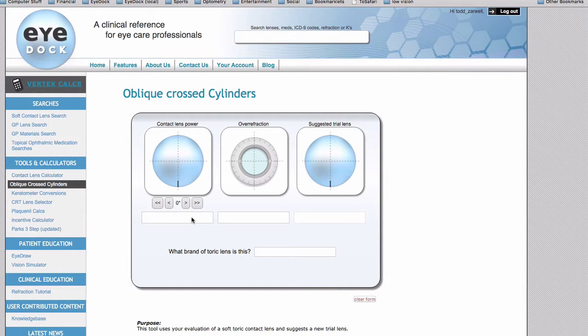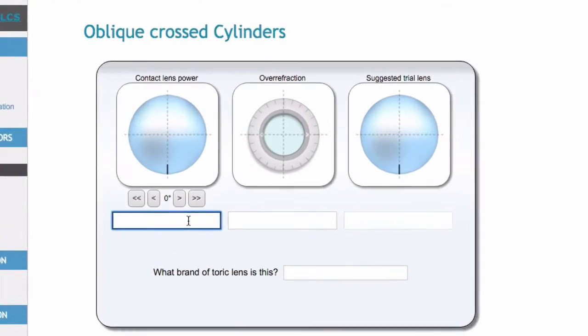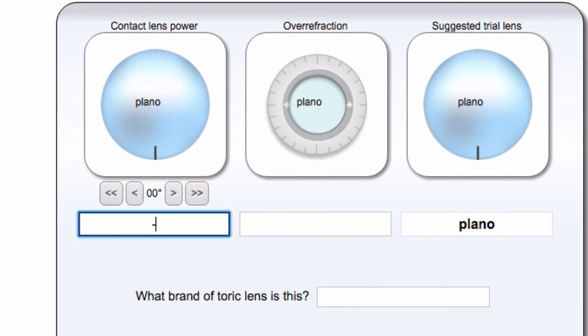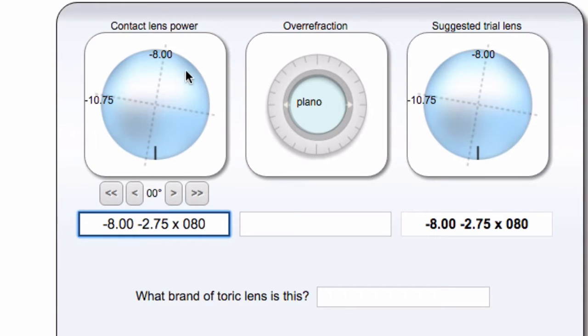You first of all type in a contact lens power in this first box. So if I'm working with a contact that's minus 8, minus 2.75 axis 80, you can just type that in, and as you go, it will automatically parse the information and put the powers on the meridians on the optical cross on the contacts.